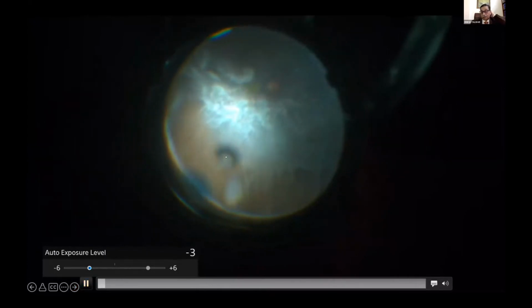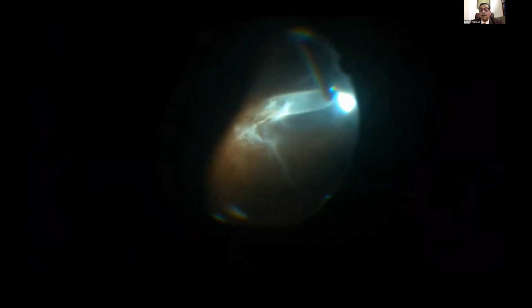So you see over here, this was a patient in whom these membranes were being removed, vitrectomy is being done, and they tried to remove these peripheral membranes and found it very sticky. They're having difficulty in removing it. So put PFCL to check whether there are any membranes at the retinal surface near the posterior pole. Couldn't remove any more. Again, tried to remove the peripheral membranes and is finding difficulty in removing these membranes. And finally decided to do a retinectomy to settle this.